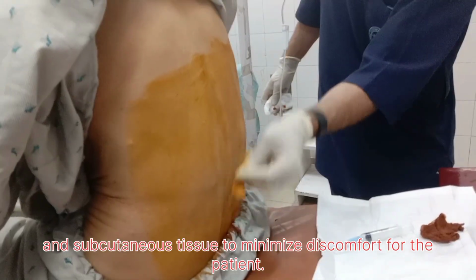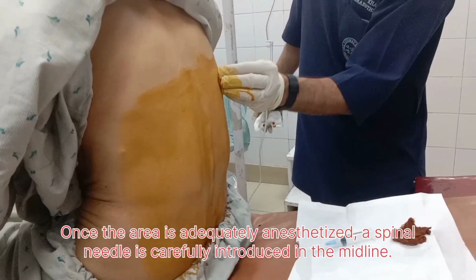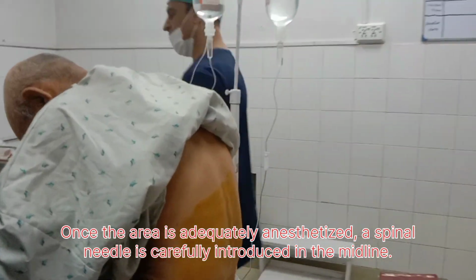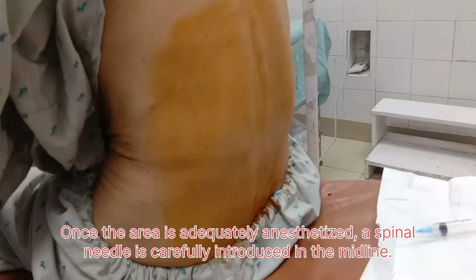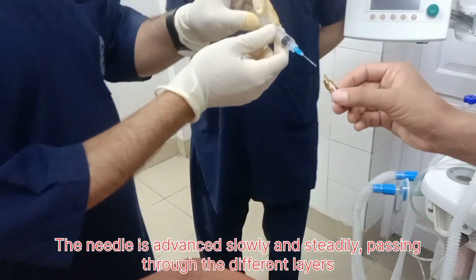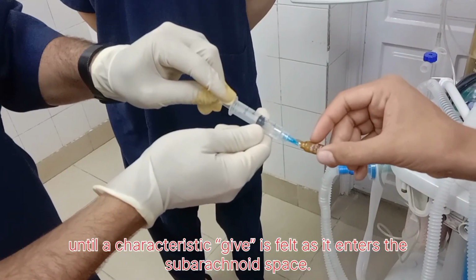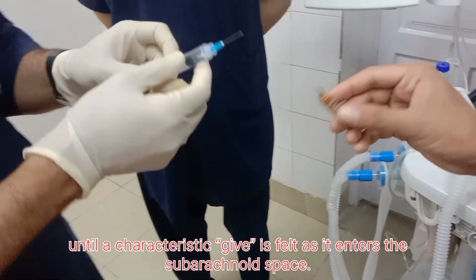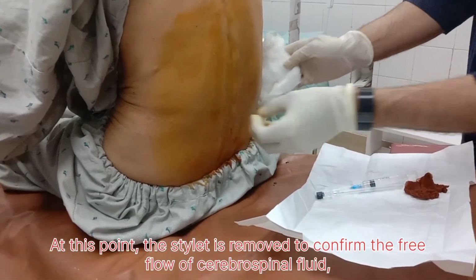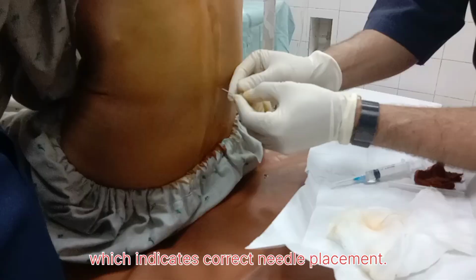The needle is advanced slowly and steadily, passing through the different layers until a characteristic give is felt as it enters the subarachnoid space. At this point, the stylet is removed to confirm the free flow of cerebrospinal fluid, which indicates correct needle placement. Once proper placement is confirmed, the required dose of anesthetic drug is injected slowly into the subarachnoid space. The needle is then withdrawn carefully, and a sterile dressing is applied to the puncture site.